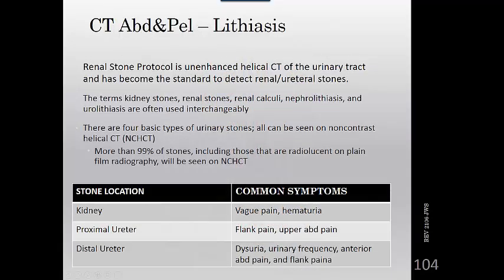Imaging plays an essential role in the diagnosis and initial management of urolithiasis, or kidney stones. The imaging methods used have undergone considerable evolution in recent years. One major advance is the use of non-contrast helical computed tomography, or NCHCT, in patients who are suspected of having renal colic.